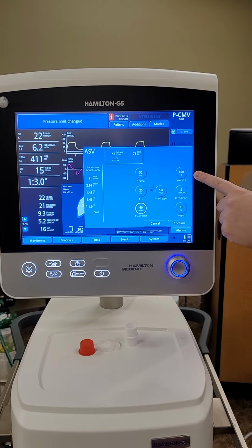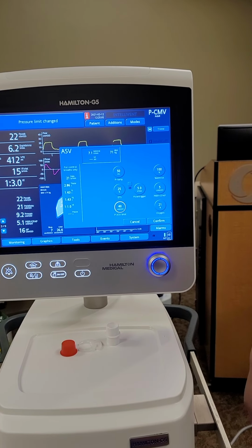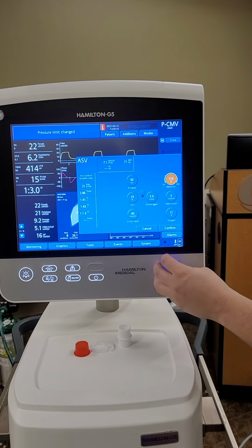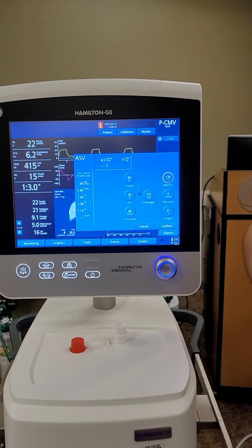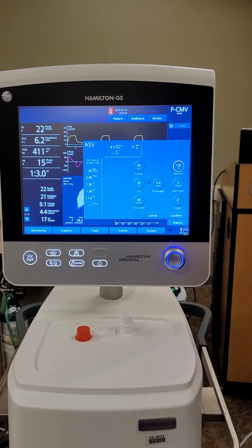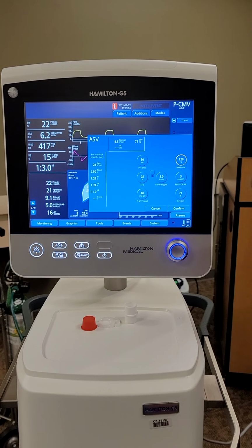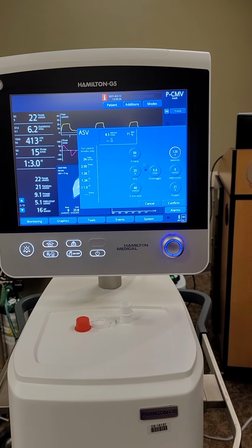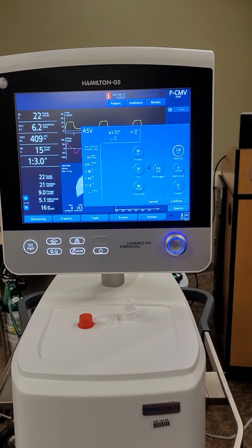Your percent here replaces what? Rate, target tidal volume, and I-time. If your patient has a fever, they would probably need to start a little bit higher here. If your patient is working, I usually increase this as well to try to capture them, because it's the same principle as APV. If you have somebody working really hard, what's it going to do? It's going to wean the pressure out from under them. One of the whole points of this mode is to get better patient synchrony.